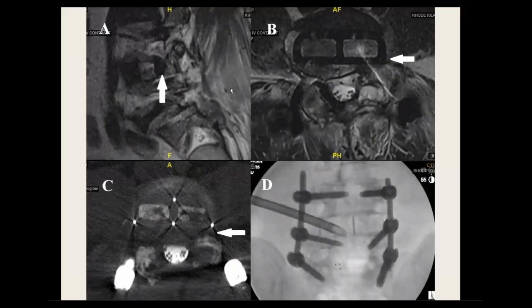And the last pathology I'll discuss is actually direct compression from the lateral fusion cage. So this patient had an L4-5 lateral fusion. The surgeon approached from the right, but you notice the cage was pushed in a little too far. I think this happens to us a lot of times without any patient complaints, but in this case, it was enough to compress the patient's exiting L4 nerve root. And you can see this, it's probably just this little edge of the cage here.